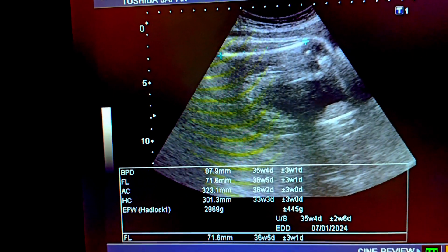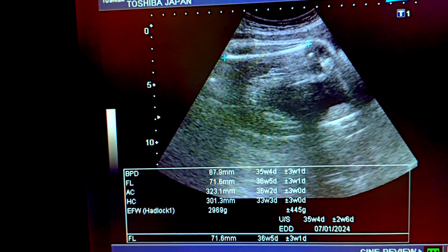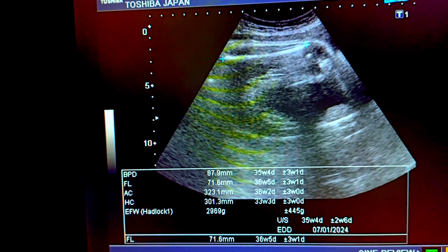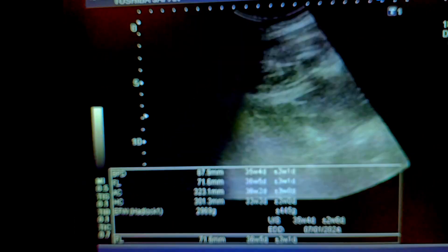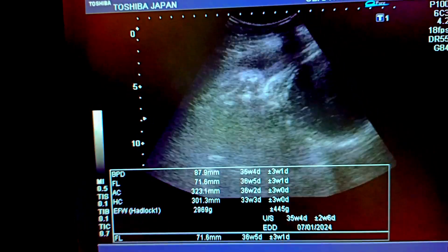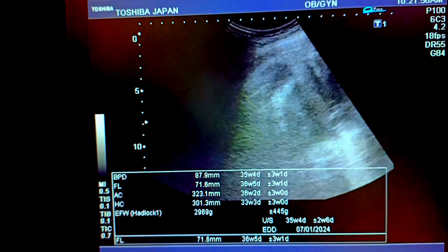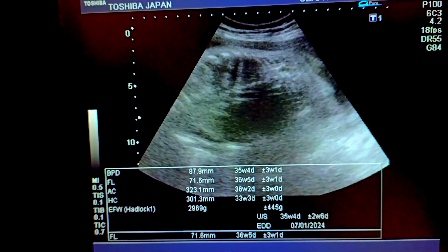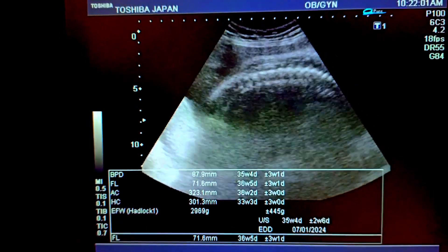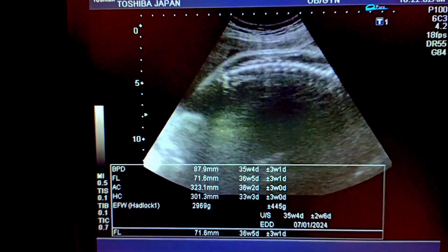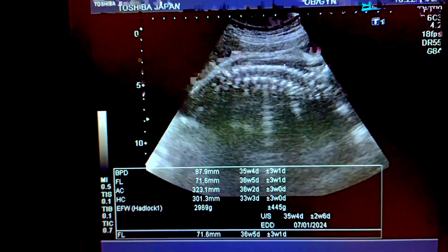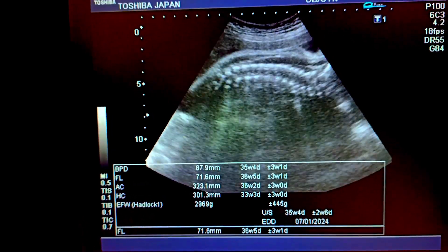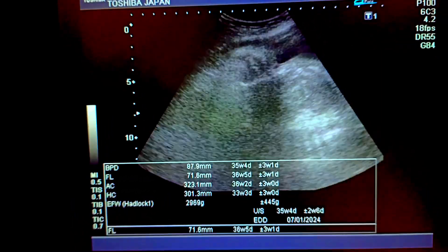Again, see the femur length, fetal weight, and expected date of delivery. BPD, HC, and abdominal circumference — the placenta is fundoposterior. See the railroad phenomenon: there is no gap in the spine from the cervical to the sacral region.